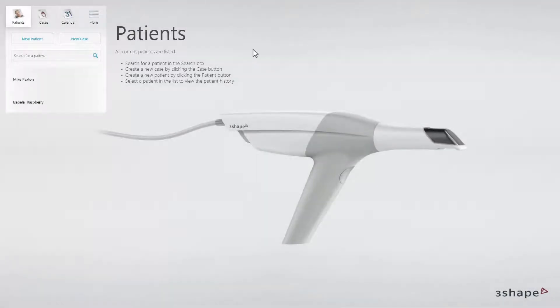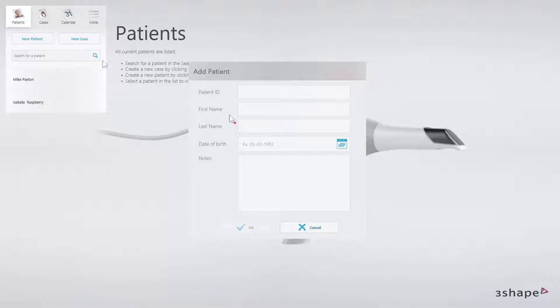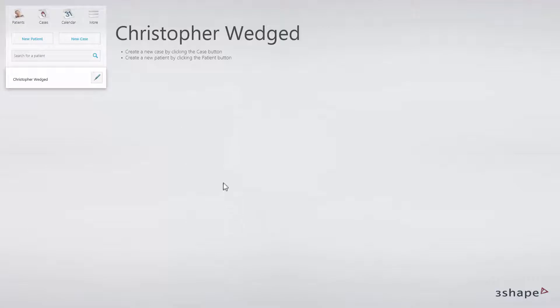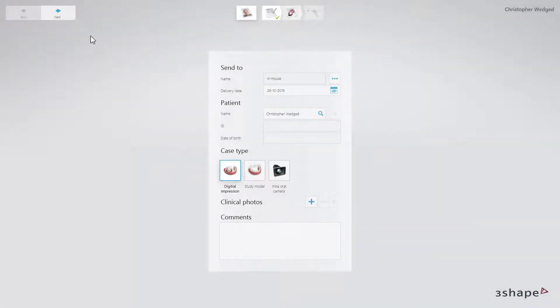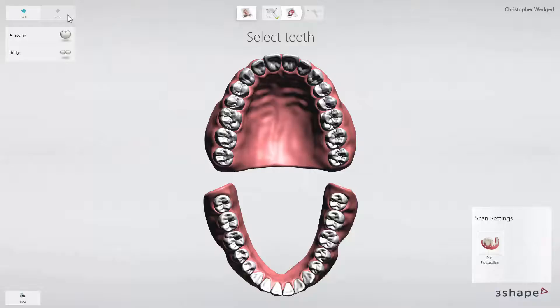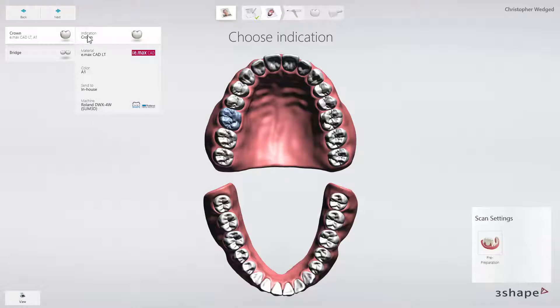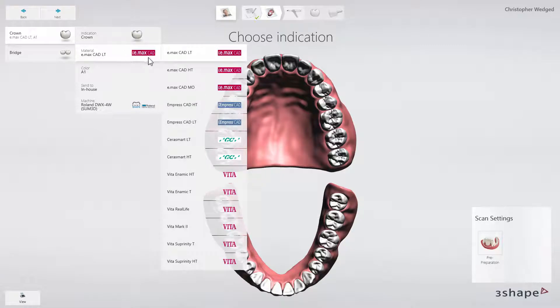You can start working on the next restoration on the patient page. To create an order form, click on Patient and fill in the details. Then click on Case. The current stage is highlighted and marked green when accomplished. In the second stage of order form creation, choose Tooth, Type of Restoration, Material and Color.